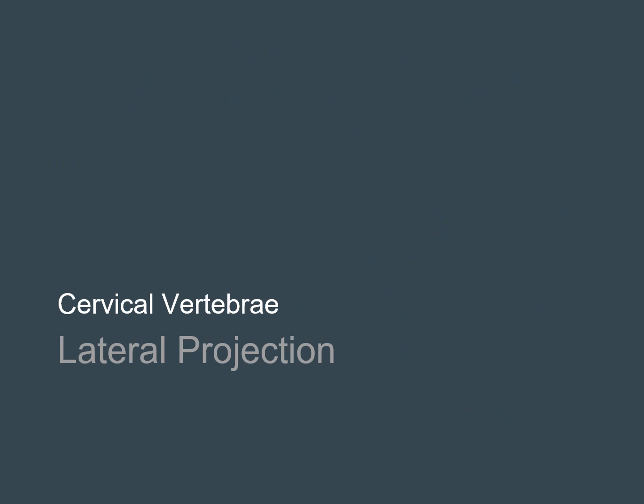So moving forward, let's talk about radiographic image analysis guidelines for a lateral C-spine projection.